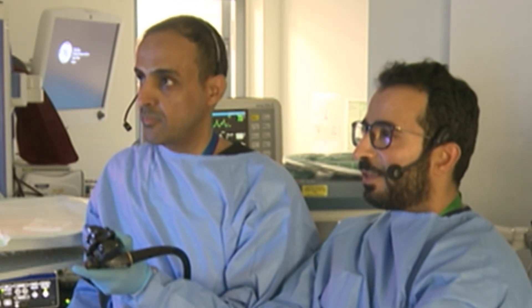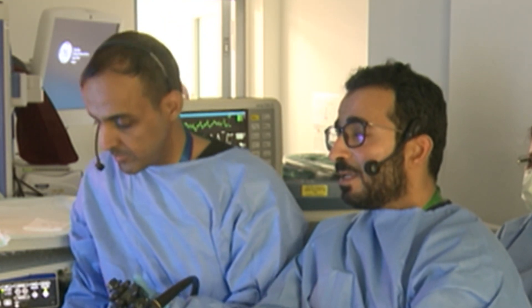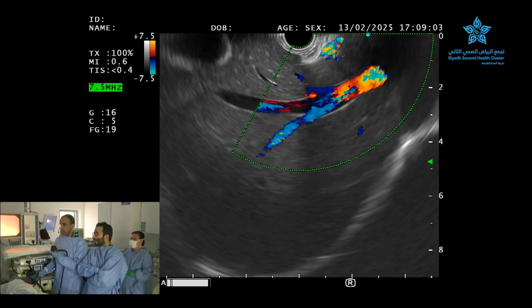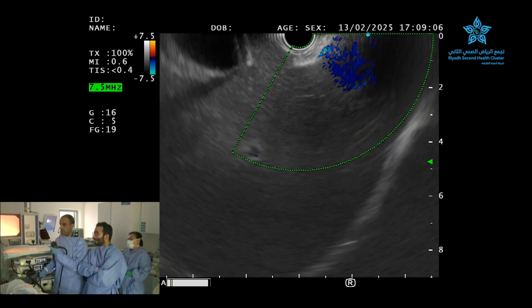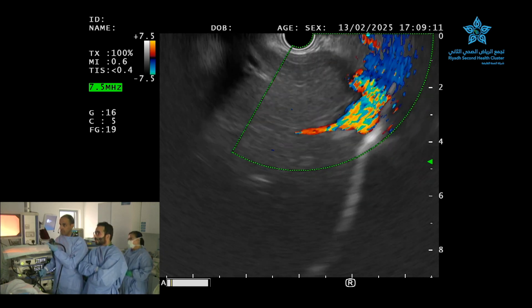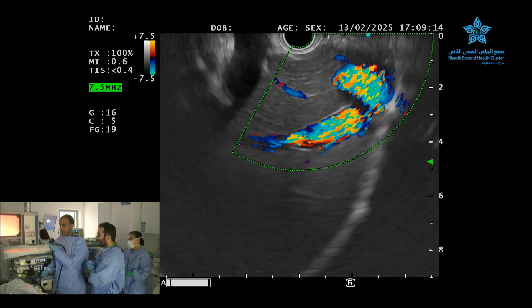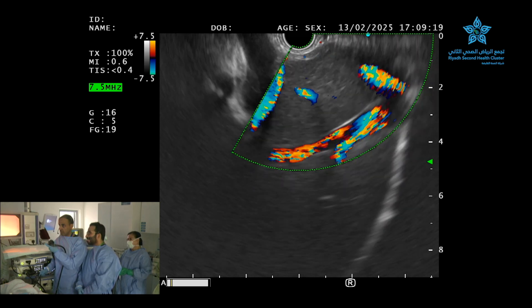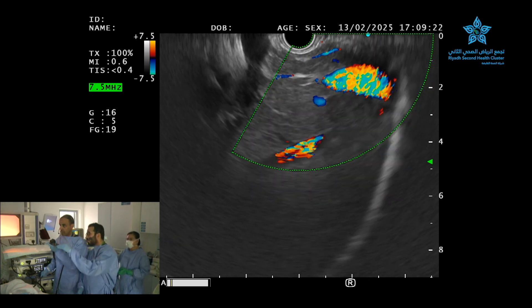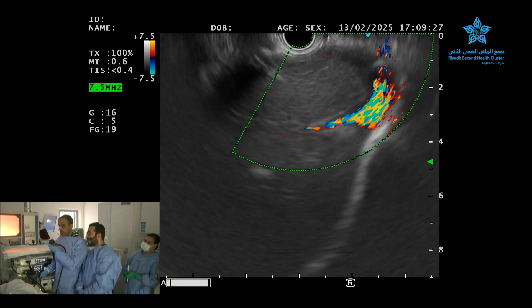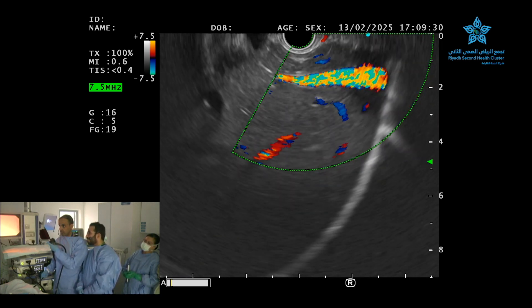For the liver biopsy, if we go more clockwise we're going towards the heart, so we can look at the anatomy. Going clockwise, we can see here the IVC — the inferior vena cava — and the vessel going down posteriorly is the right hepatic vein. The most distal segment will be segment eight, and the closest segment to the transducer is segment one.